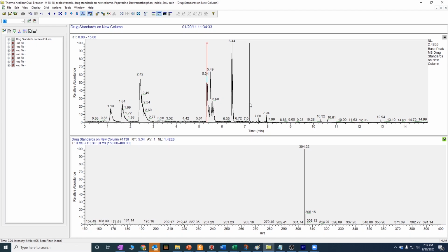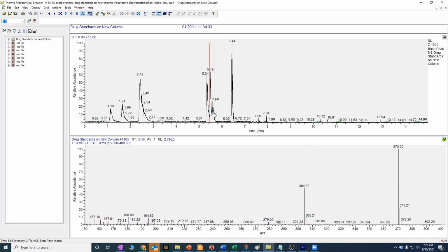So first of all, these 3 peaks are definitely not completely resolved, but we think there's 3 peaks there, but we get to see for sure. Okay, 304, that's got to be cocaine, but I'm going to run through these scans. Okay, and as this peak fades and the next peak grows in, we are going to see, so right here, we have both the cocaine and the heroin.